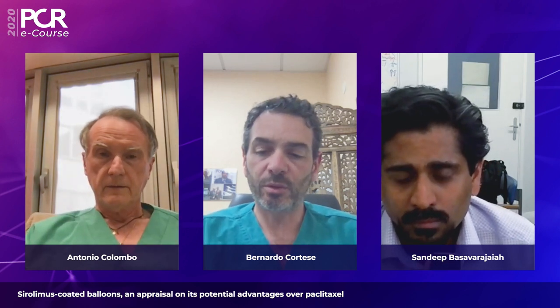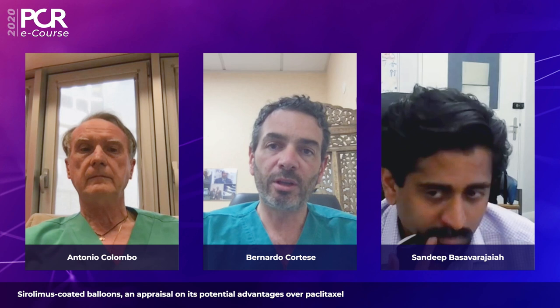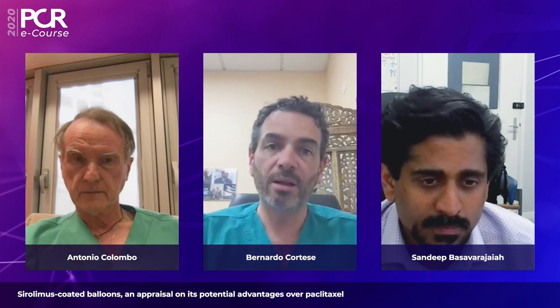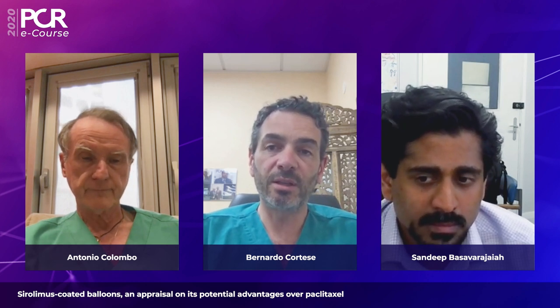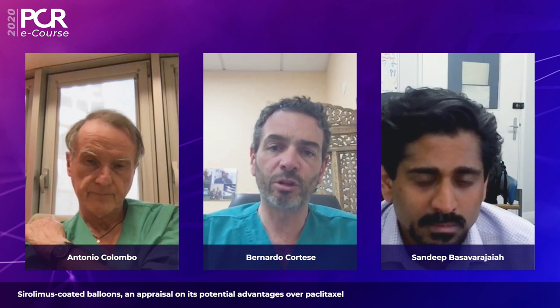What about your experience with the native vessel disease? So we started using drug-coated balloons for in-stent restenosis 10 years ago. Now we have seen some data that show that DES is probably better, not only in terms of angiographic follow-up, but also in terms of TLR, which is a hard endpoint for us in this type of lesions. We have seen that Sirolimus seems to work well also in the ISR setting. Also because in this registry that we have seen, there are not very simple in-stent restenosis lesions, so they are more diffuse. We also put in this one, for example, some total occlusions.